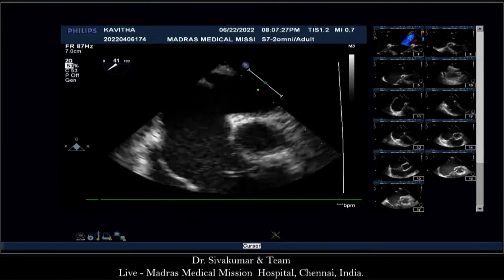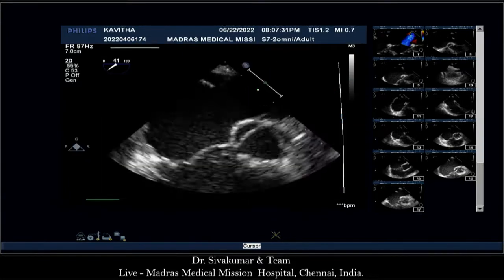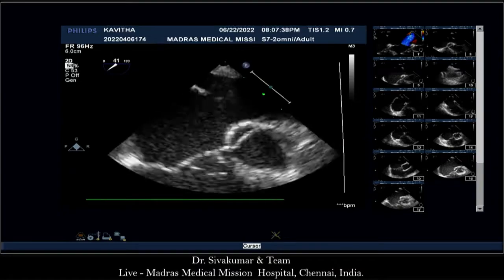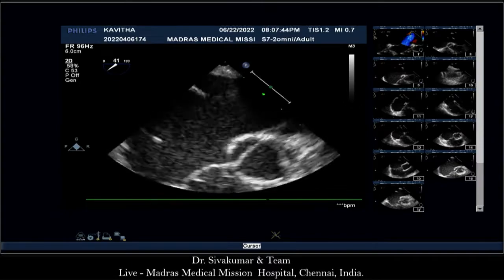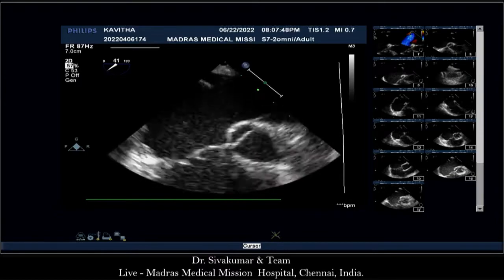Dr. Kagi is there. So, what do you think? Is it a malaligned septum? Teji, hold on. Let's give you a microphone. Teji is an expert on malalignment. I think that they are correct for the measurement. The septum primum is touching the far back side, left atrial side, and septum secundum is at 10 o'clock for the aorta.